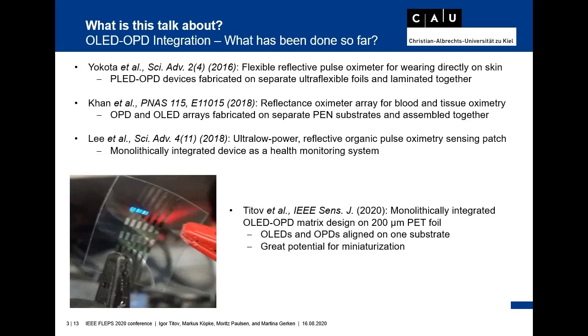An also really interesting approach was presented by Mr. Lee. He and his co-workers presented a monolithically integrated ultra-low power OLED-OPD pulse oximeter. We also showed our results, already published in April this year, on a monolithic integrated OLED-OPD matrix geometry on a PET foil.